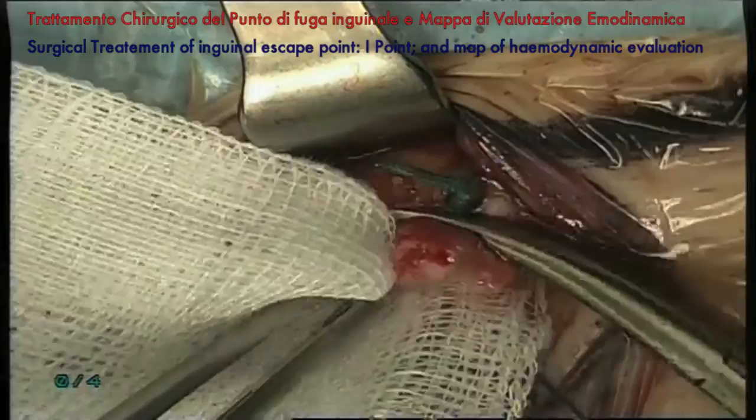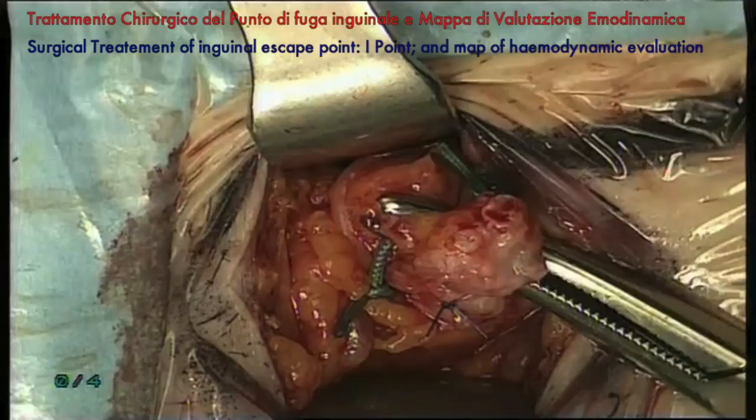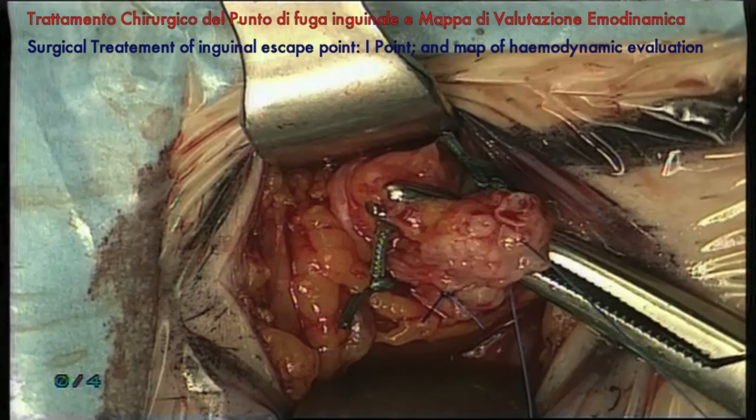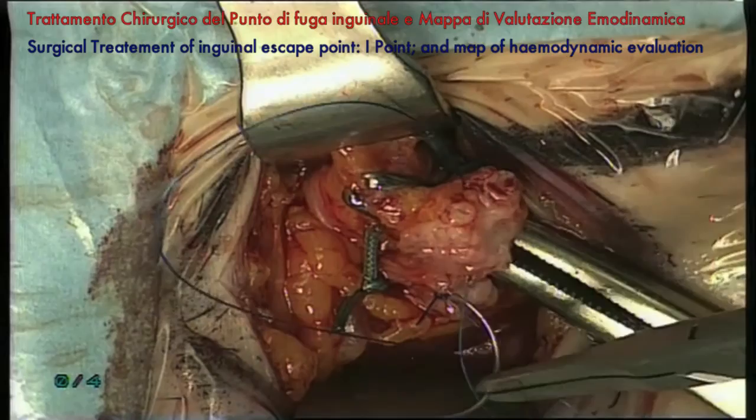Questo è il moncone distale che verrà abbandonato. This is the distal stump that will be abandoned. C'è una sufficienza, forse. Perché lo introfletto proprio qui. Proceda allo stesso modo sul moncone prossimale. The doctor is proceeding in the same way at the proximal stump.